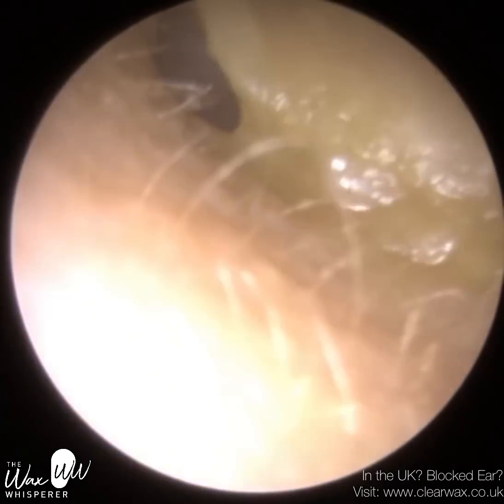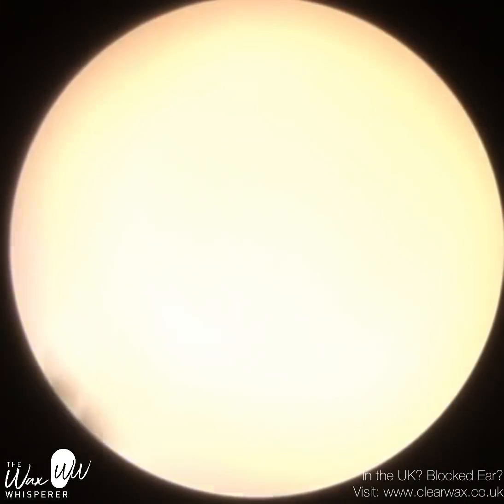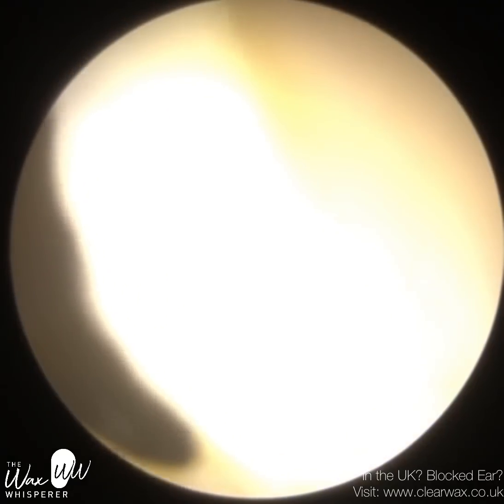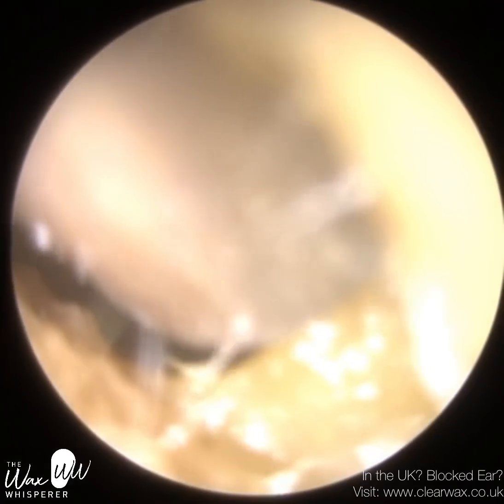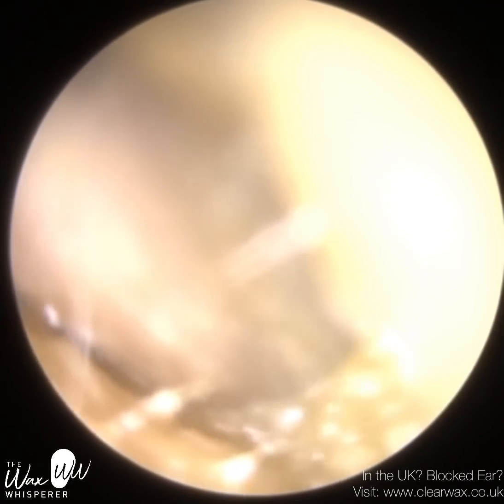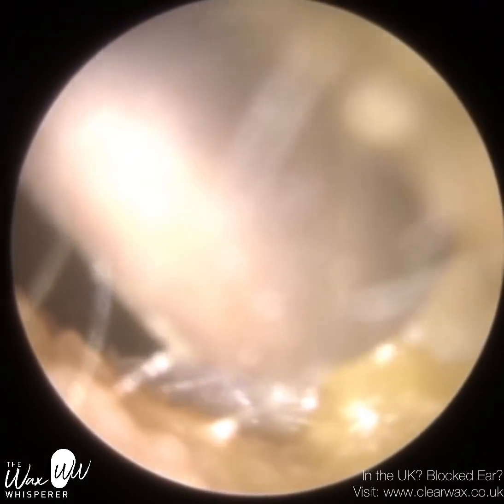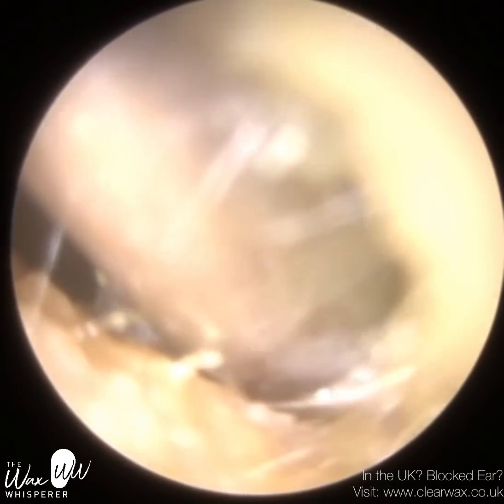So that's the patient's right ear. We've recommended them not to wear their hearing aid. Now, on their hearing aid, their earpiece, the mould, they've got a ventilation tube that was blocked, and that's not going to help. When someone's prone to otitis externa, so this outer ear infection, you want that ventilation hole to be open so it breathes and it allows air to enter and exit the ear to aerate it, helps circulation of the air as well.